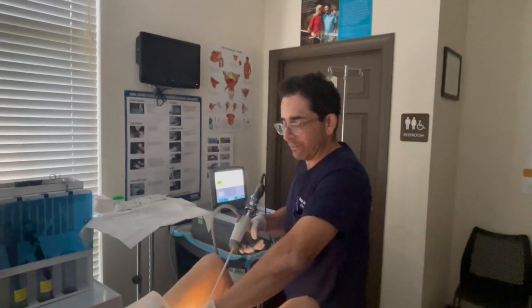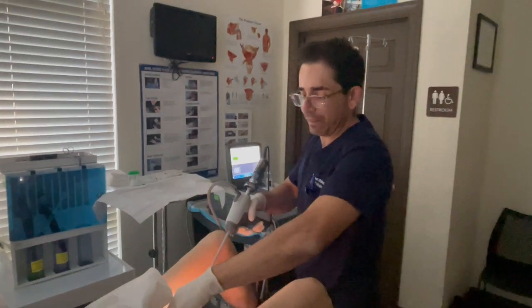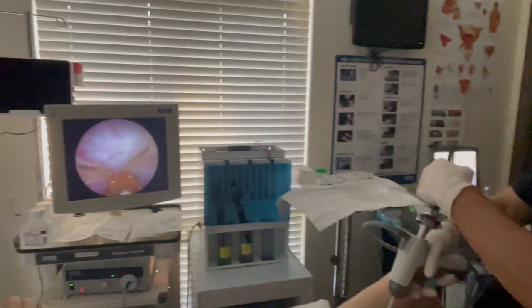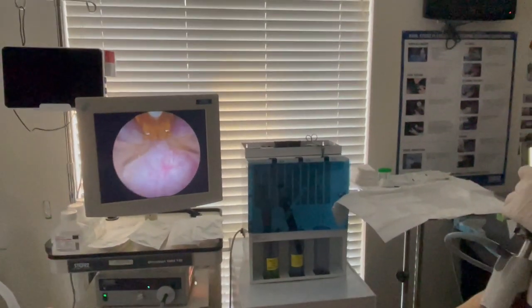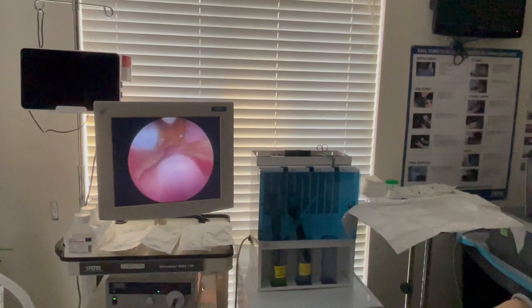Hey, it's Dr. Mike here. We're doing a Rezum on a 50 gram prostate. We've had a busy day here with cystos and bladder cancers. Just got to make sure the counter head is in the right direction. Let's take a look.